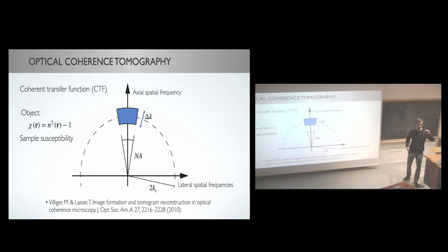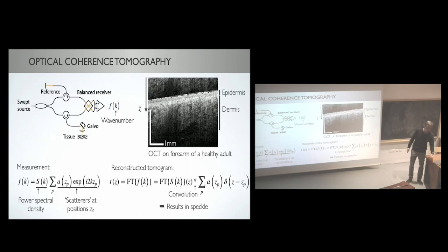What's really intriguing about OCT is that each wavelength itself samples a specific slice in this K-space, and all wavelengths together probe this K-space. By taking the Fourier transform from K to path length, we recover that reflectivity profile. So in the axial spatial frequencies, OCT is like a bandpass operation, and in short, it's a hand-waving argument for why we have speckle in OCT imaging.